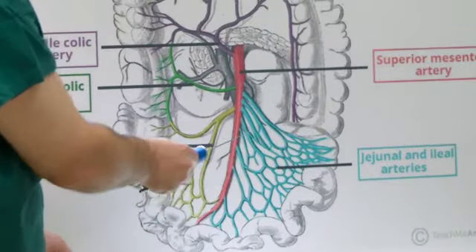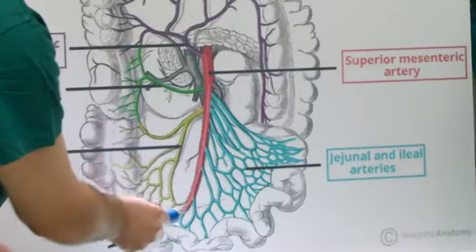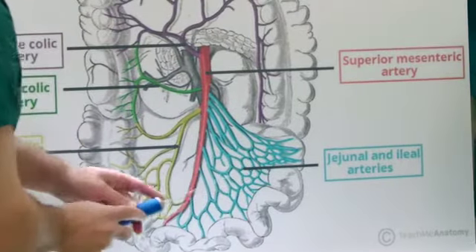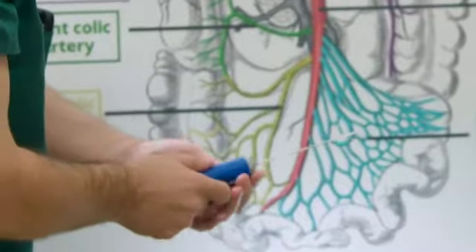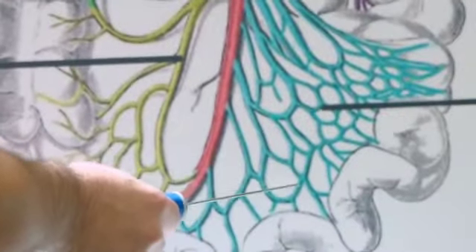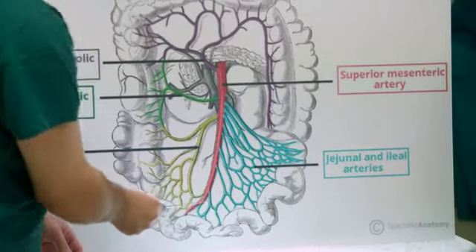You'll see actually in the surgery itself, we call these arcades. You see they're sort of loops, and there are lots of little ones. And this particular device, as I'm using as a pointer as well, is the HydraSolve cannula device that we use. This actually allows us to go into these areas here and really extract the fat without injuring or hurting any of these vessels. So it's very safe in that respect.